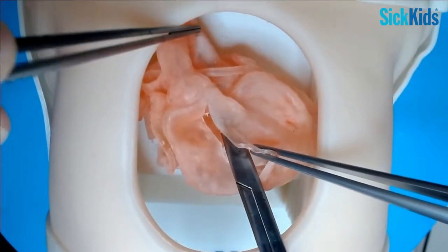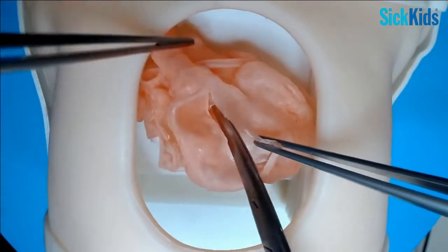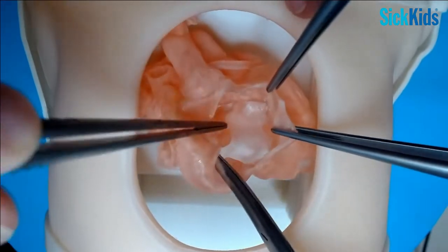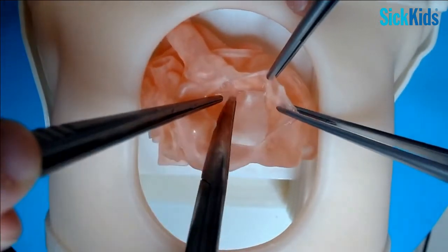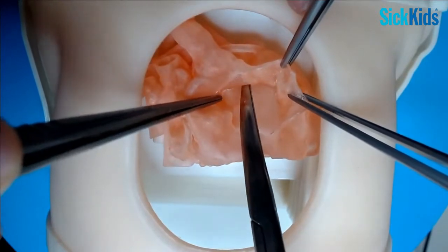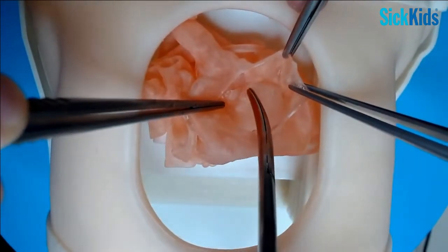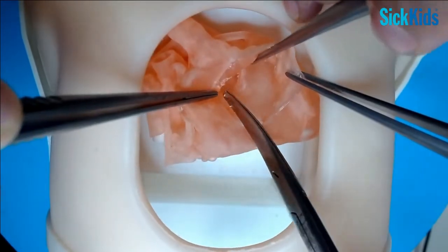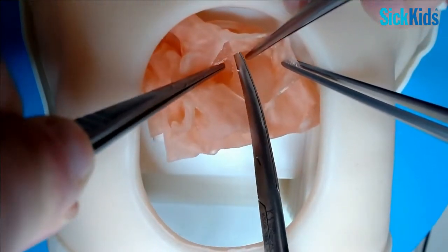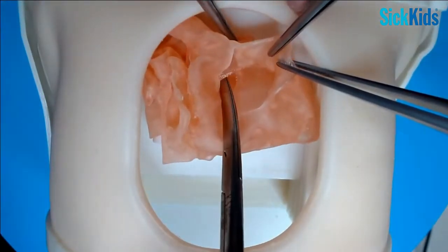If you're not sure, you can take your time - pass the instrument into it, there's my scissors inside the pulmonary valve, so you can see where you want to be. There's the VSD - how are you going to commit things? There's a nice ridge at the top. Your VSD patch is going to have to come around here, up onto this ridge, and then down here. The most difficult bit is on the far side, because it's quite a long way away.